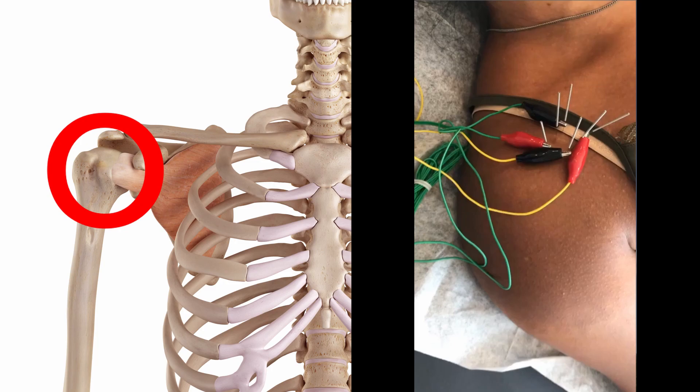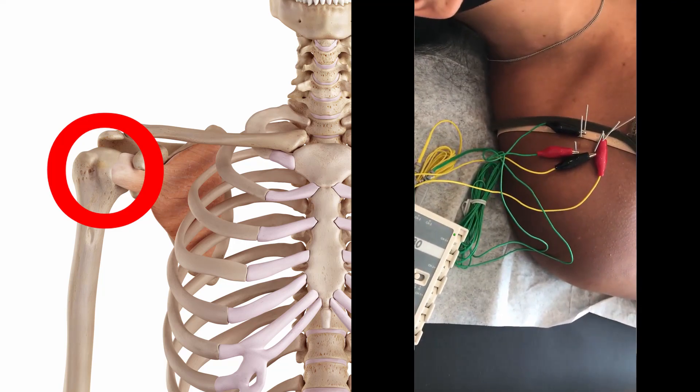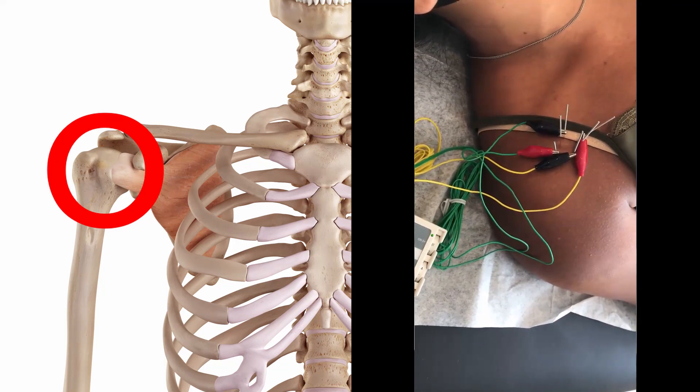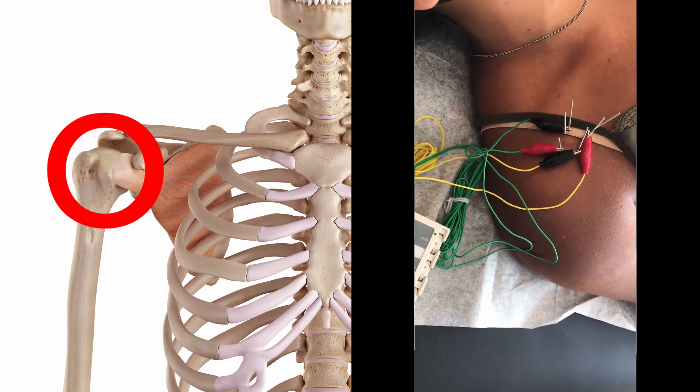Additionally, I want to show you another case of shoulder pain treated with the same treatment points using electroacupuncture. Speaking of intensity, I recommend going as high as possible, up to the level the patient can endure. This patient was extremely tolerant of the acupuncture stimulation, so I used about six or seven out of ten.